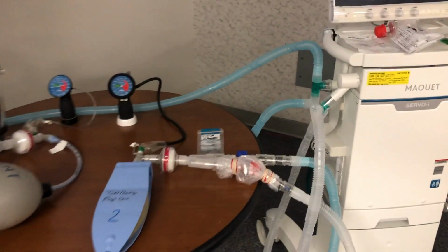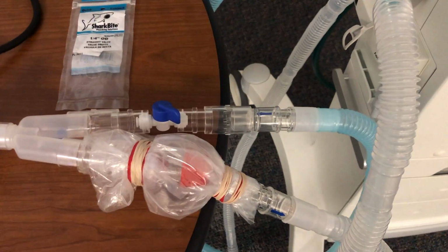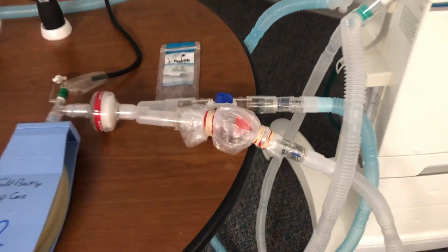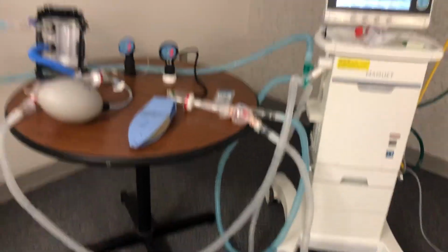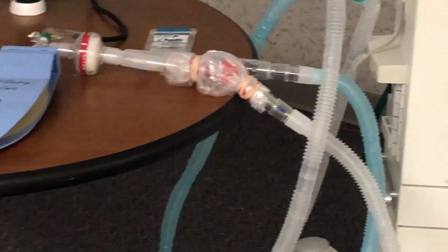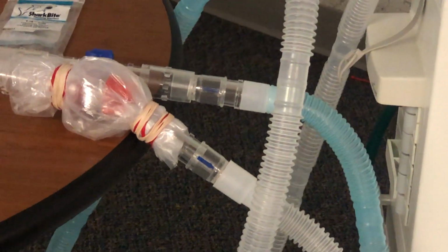Please see that you need to put the one-way valves right in that position where I have put them, and the reason is because there are multiple patients here, and one's back pressure or PEEP may affect the back pressure of others. So the valves have to be in position, and that is another key thing for the patient not to affect another patient.